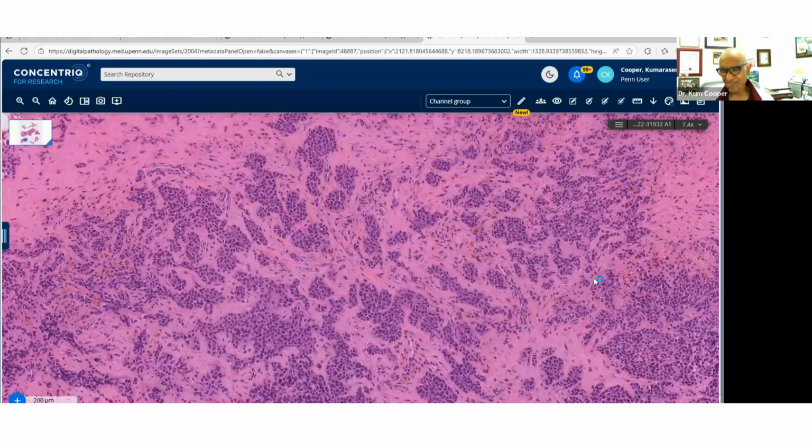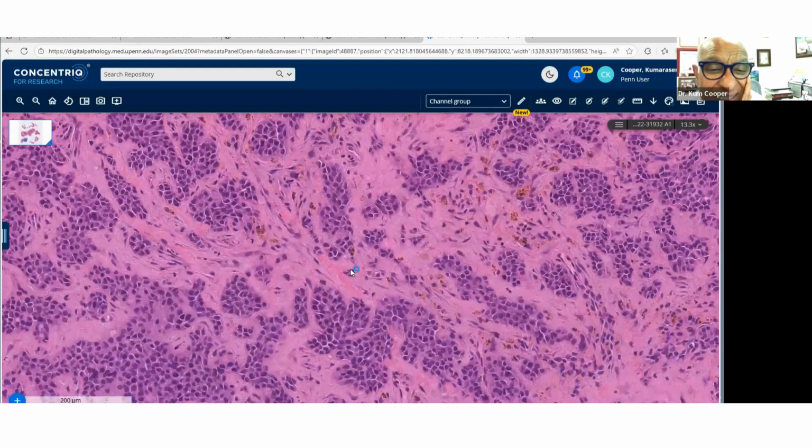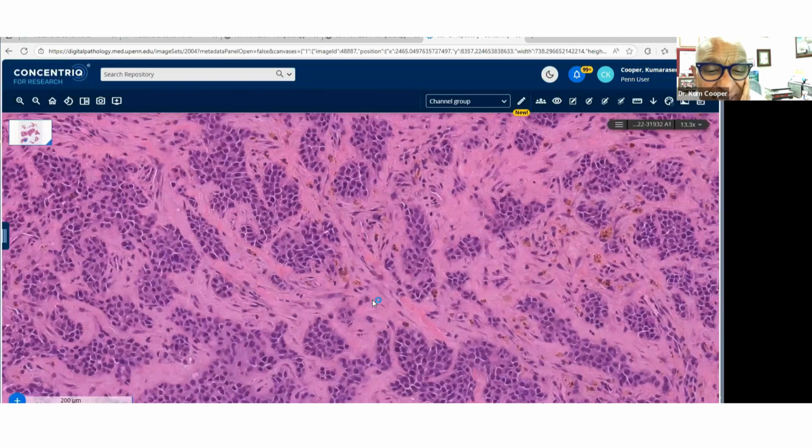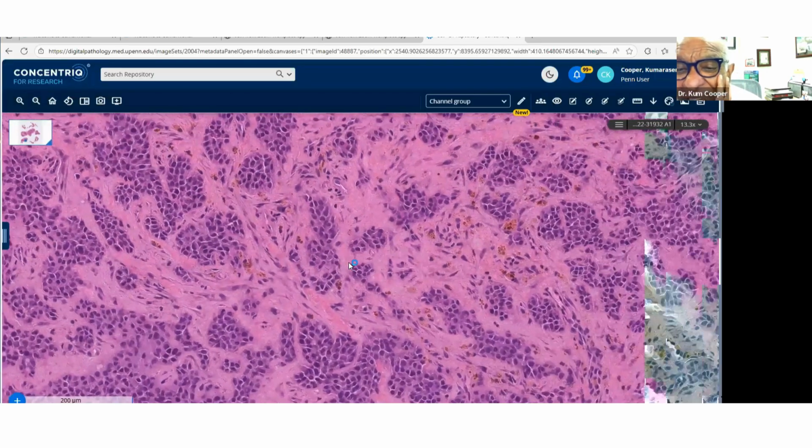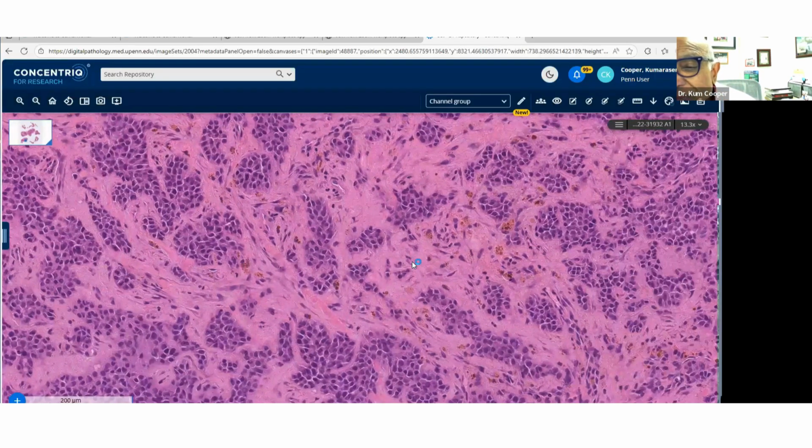All right. Any questions or comments? This is a rare location for a rare tumor as well. So looking at it again, there's some pigment in the background. There's some astute. Who is this? Michael. Yes, you are correct, Michael. That's a very good question. This pigment is refractile, Michael. It's refractile and much more granular. So I interpreted this to be hemosiderin, just from blood and hemosiderin.